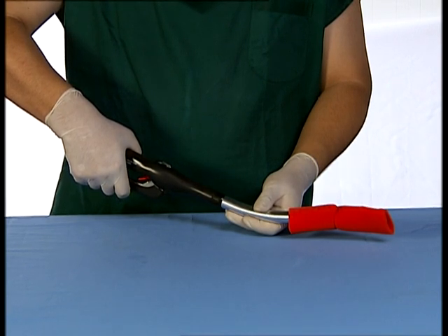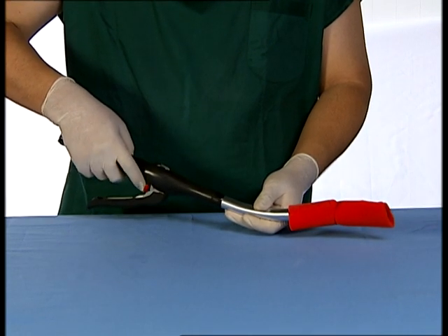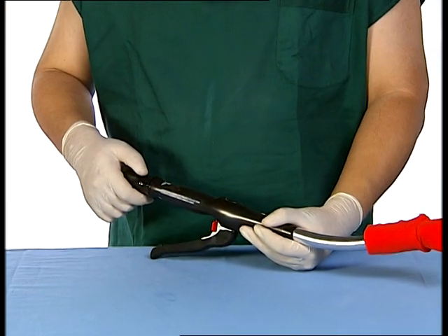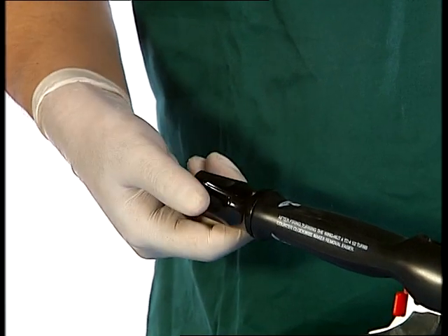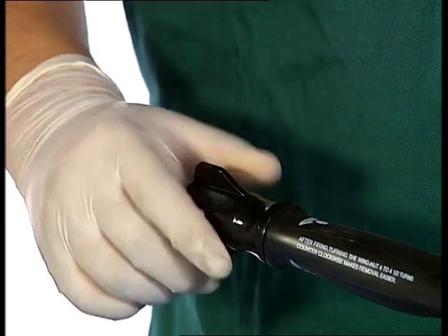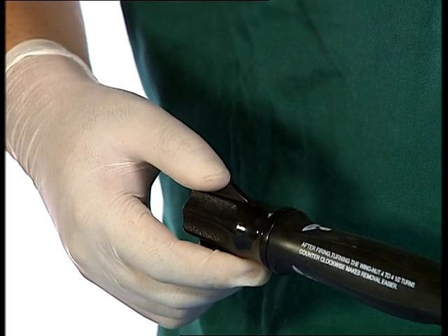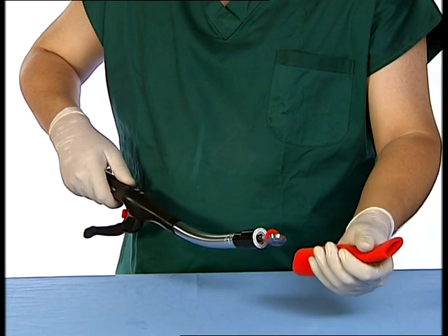After firing, release the firing handle, allowing it to return to its original position, and replace the red safety lockout tab. Ensure that the circular knife is retracted into the shaft. The wingnut should be turned counter-clockwise four full turns to create sufficient space between the cartridge and anvil, and then remove the instrument. Four full turns will allow the anvil to tilt on its side for easy removal through the anastomosis. Gently pull and remove the instrument straight out of the new anastomosis.